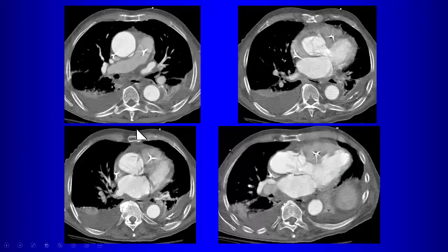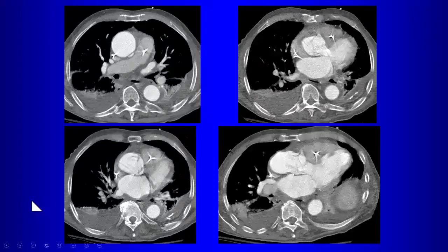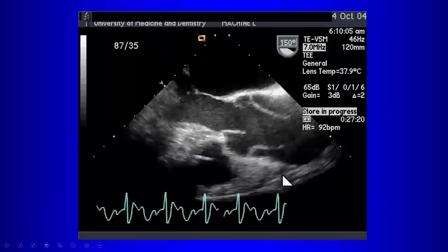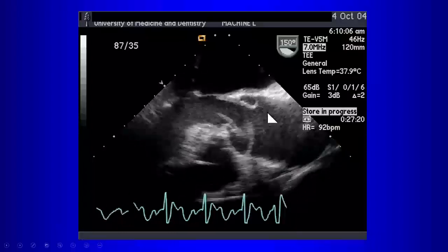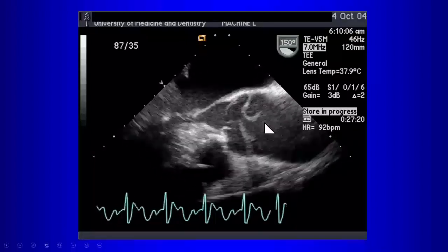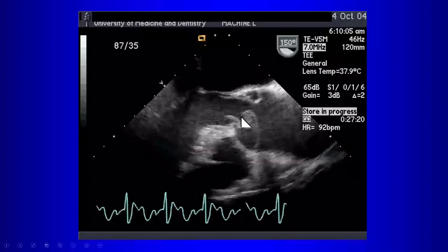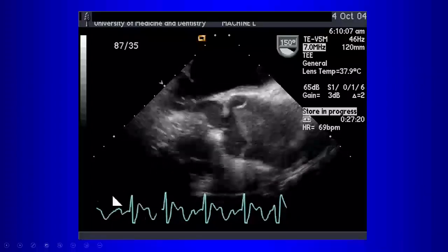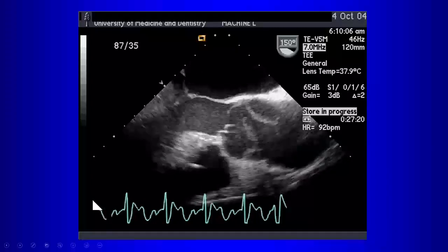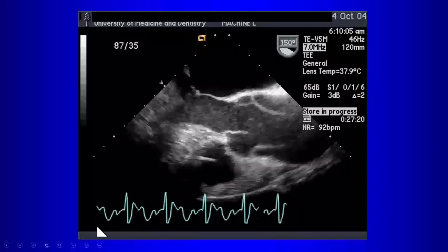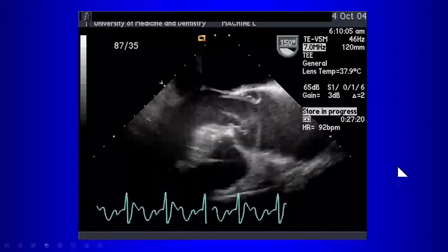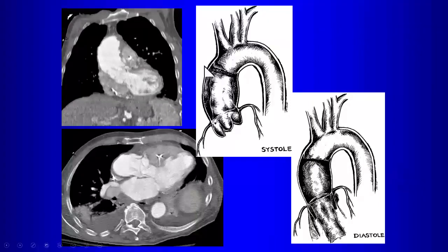Another unusual appearance: in this dissection of the ascending aorta, the patient had aortic valvular regurgitation. During diastole, the dissection flap is pushed down into the aortic valve, preventing it from closing and resulting in regurgitation. So the flap during systole is pushed forward, and during diastole it is pushed backward into the aortic valve.